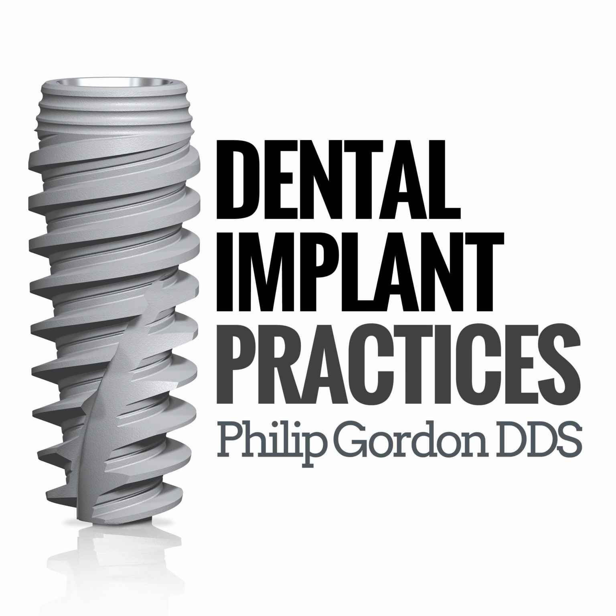And then we take the 2 or the 2.5 millimeter surgical drill next to length. And at that point, I recommend leaving the implant drill in the bone and taking your first x-ray with the drill in the bone. At that point, you are moving up in size of drills, subsequently just increasing the diameter to shape and widen the osteotomy.